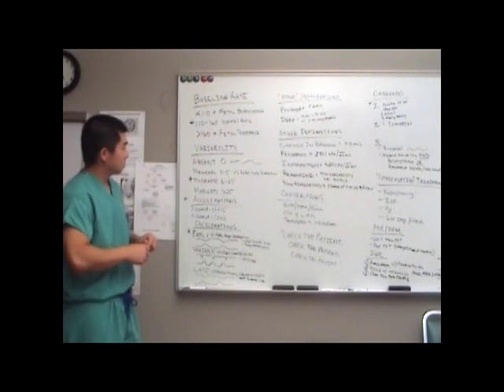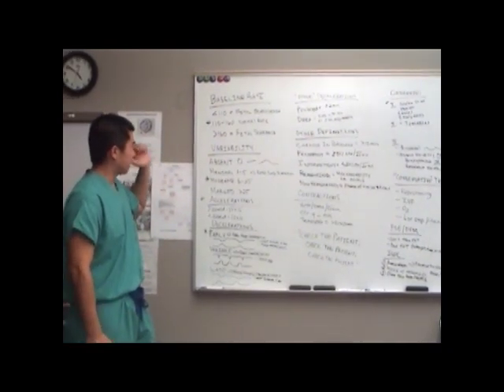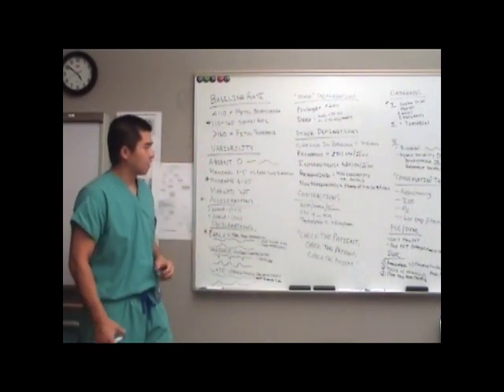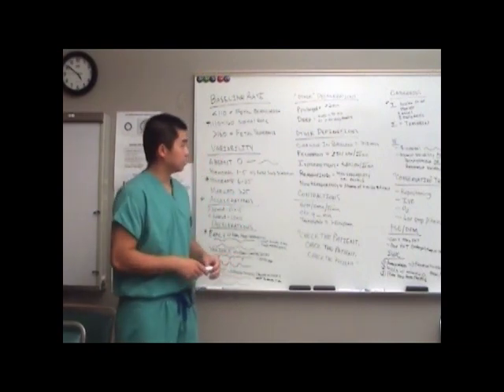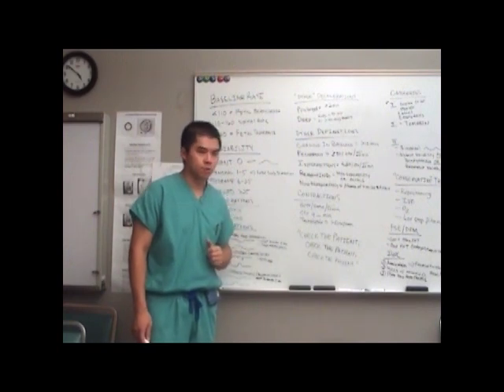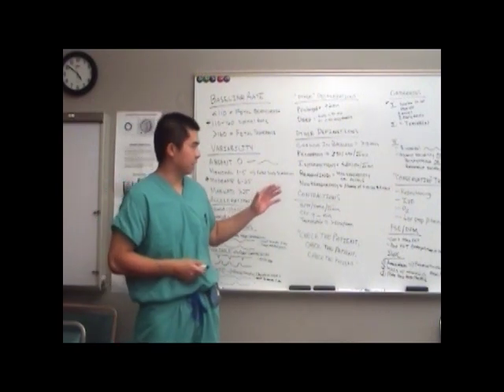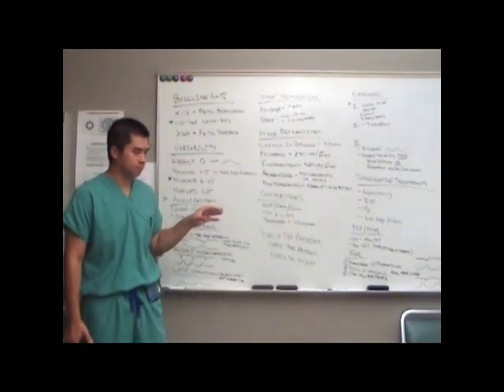And again, we went through how to read a fetal heart tracing, starting at the baseline rate, variability, accelerations, decels, other definitions that we have, and then how to read the tocometer. And again, it's taken in context of the patient that you're taking care of. And then we also learned how to categorize them with category 1 and 3 being very strict in definition, 1 being good, 3 being bad, 2 being your trash bin. How to treat those based on our conservative treatments, and also whether or not to use procedural interventions with FSEs or IUPCs.